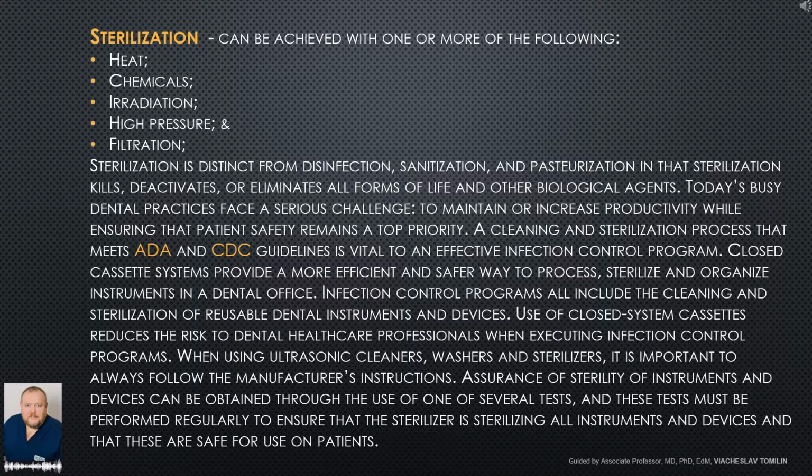Closed cassette systems provide a more efficient and safer way to process, sterilize and organize instruments in a dental office. These eliminate manual steps during instrument reprocessing such as hand scrubbing and time-consuming sorting of instruments, thereby improving safety and increasing efficiency. Effective and efficient infection control in the dental office is essential for the safety of patients and to ensure that productivity does not suffer.